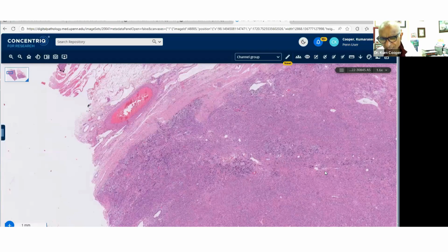Now, many of you are already wondering, why do I do two markers? That's been my approach, because you do get variation in staining based on processing, fixation, laboratory techniques, etc. So using two markers when I target a particular differential diagnosis helps me balance the two, and that's just been my practice for many years. So again, I just share with you what I do. I don't say it's right or wrong, but I justify it to my comfort level.